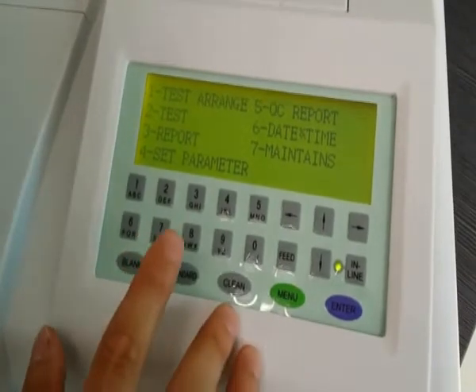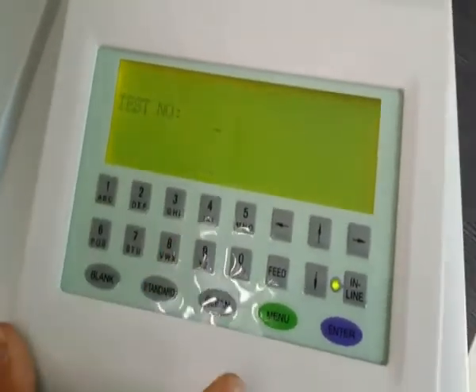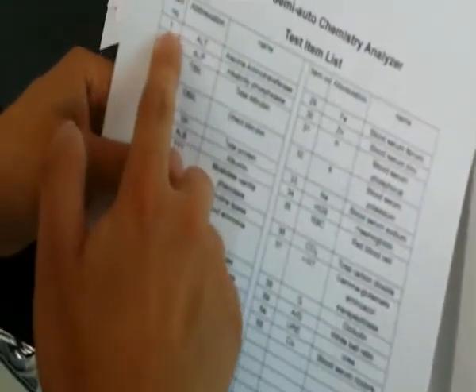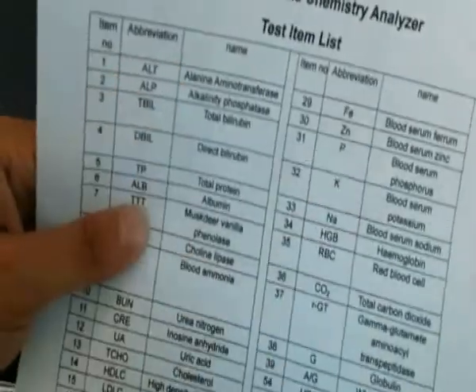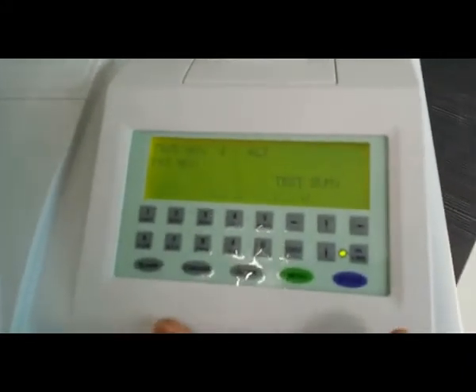And back to the main interface. We turn to the test. Choose number 2. Because we have already set the number 1, so we choose 1 here. Then it will show the ALT test.